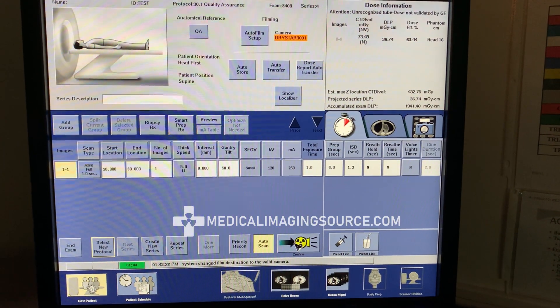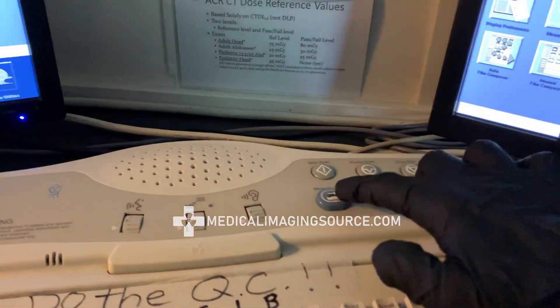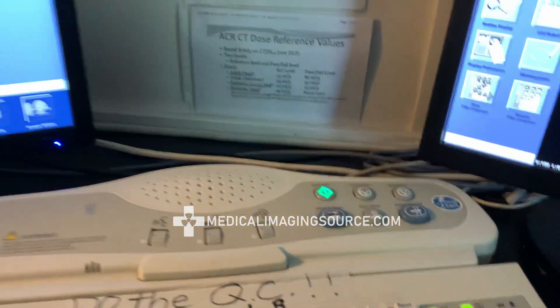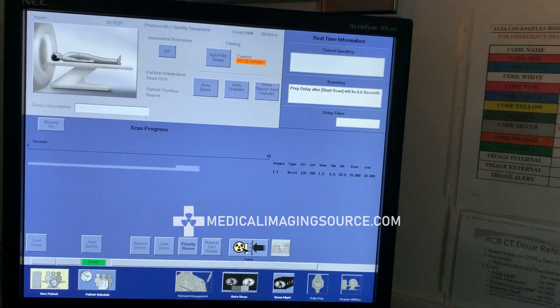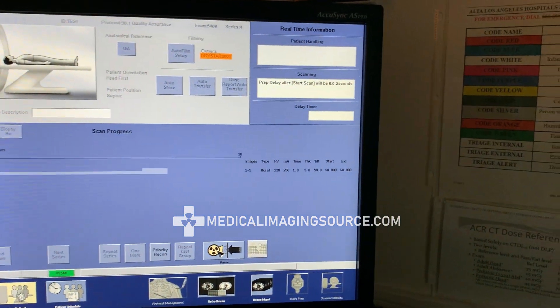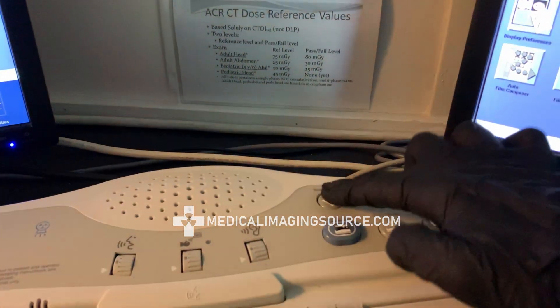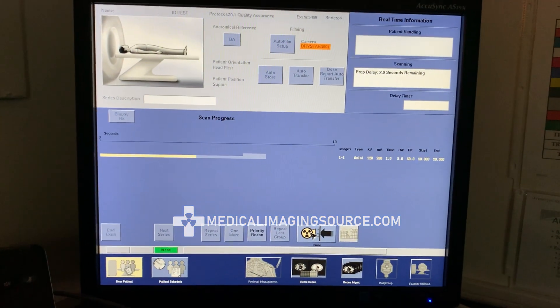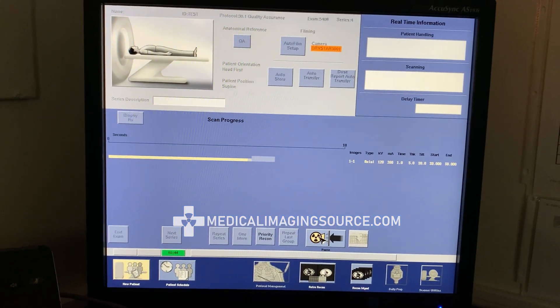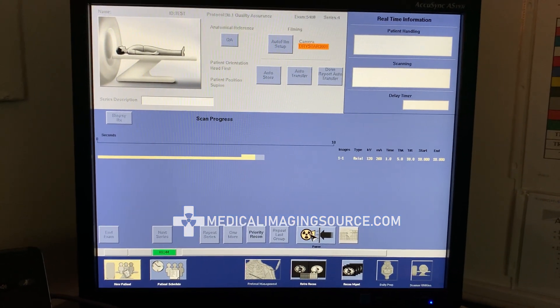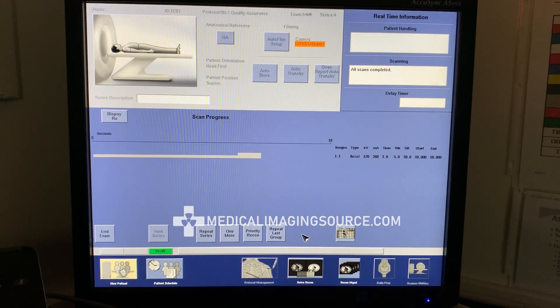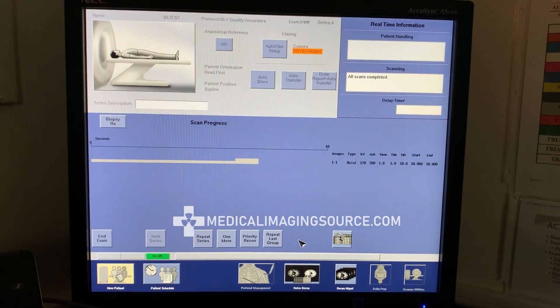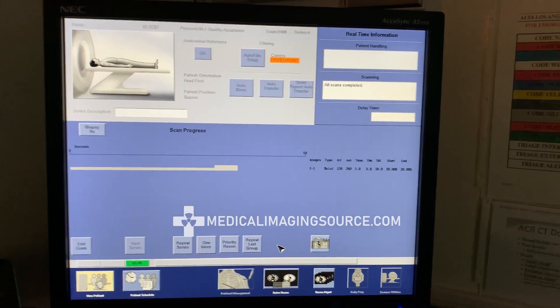Confirm. The scan button is illuminated — go ahead and press that. Prep delay will be six seconds before the series starts, most likely due to tube cooling compensation.